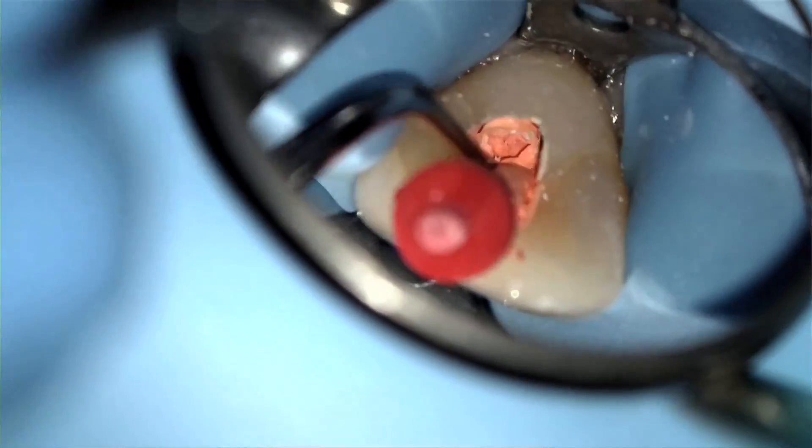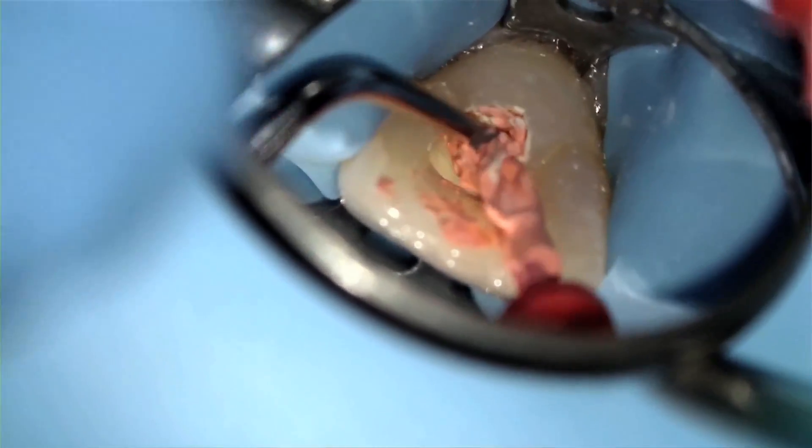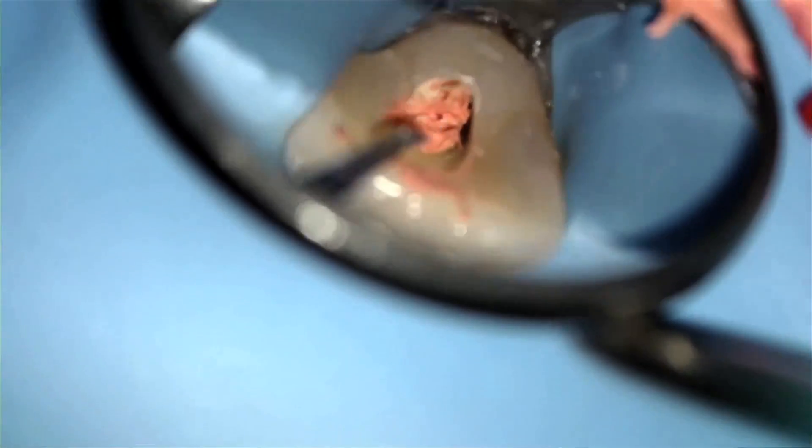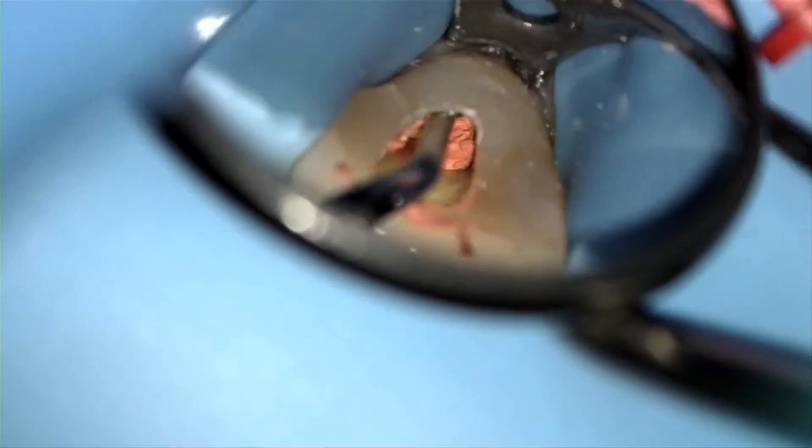Now, in the event that the gutta core is pulled out of the canal when doing this step, simply pack it back apically with a blunt instrument. You can see me doing this in this video clip during the obturation of a maxillary incisor. Although rare, when it does happen, I find this to be a non-issue since the gutta percha is still not fully set and I can still very easily condense it apically.